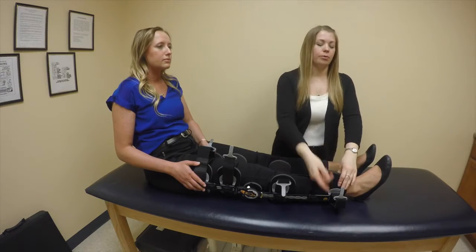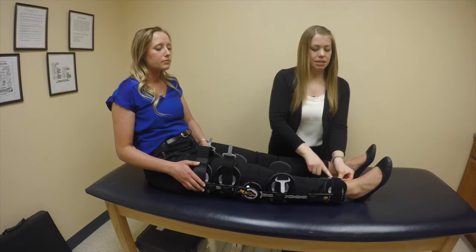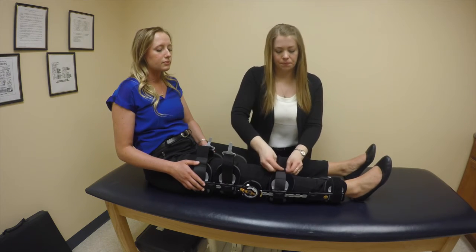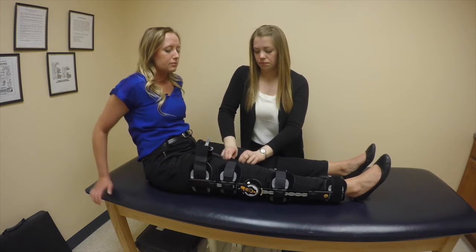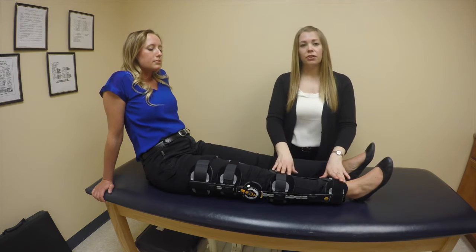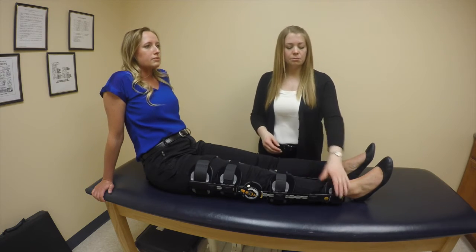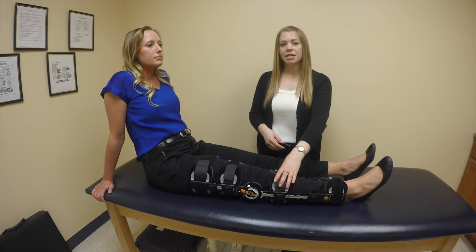You'll start at the bottom of the brace, pulling each strap around so that the gray piece snaps into each buckle. You should make sure that they're all snug, focusing on the two bottom ones as being the most tight on your brace. This will help to keep the brace up.